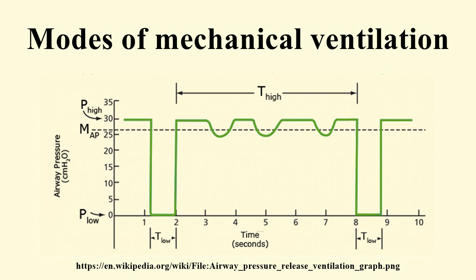In other words, the left-hand side of the equation of motion remains constant while volume and flow change with changes in elastance and resistance. Time control means that, in some rare situations, none of the main variables are preset. In this case only the inspiratory and expiratory times are preset.